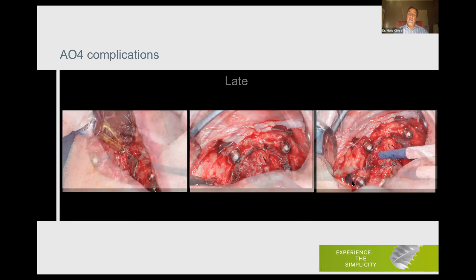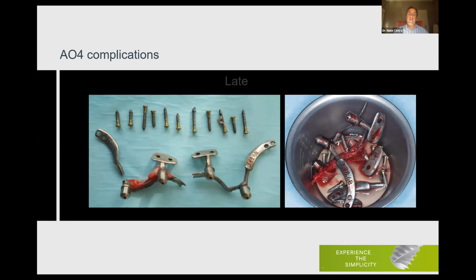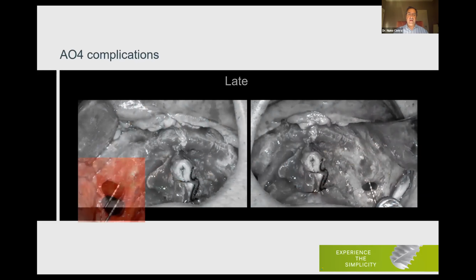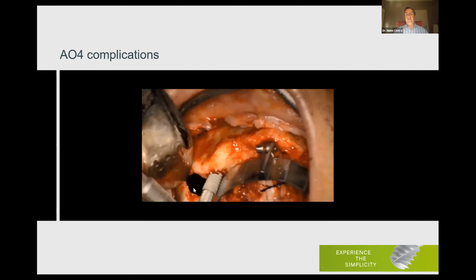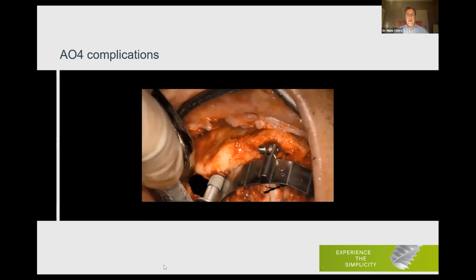So we removed the implant, and now, can you see there at the back? Look what we have. Iatrogenic sinus communications. So remove all the implants, all the screws, everything. The fracture was this one and this one, okay? And now we have this situation: 2 chronic sinus communications. So luckily they are in a position far back, so we can place our implants in front of those communications. And for that I used Alfa Gate implants.